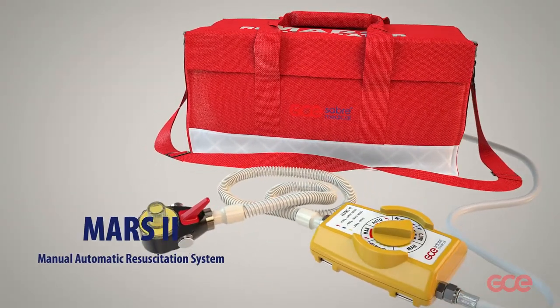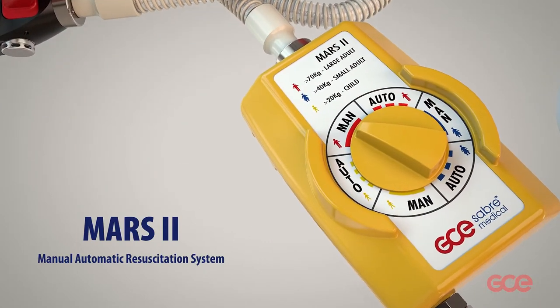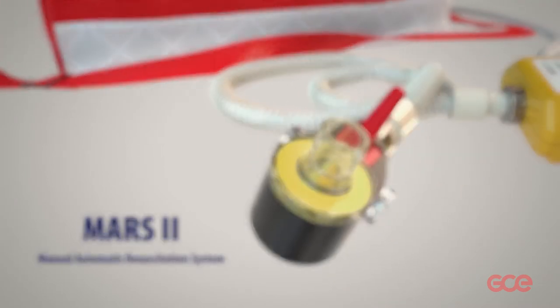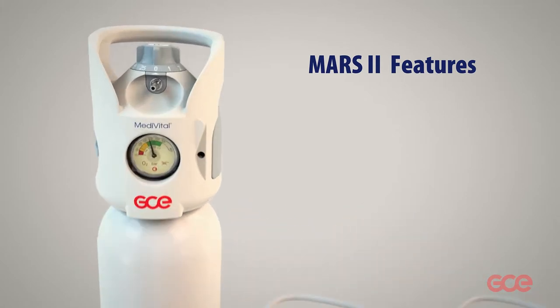Mars 2 is a manual automatic resuscitation system to be used in circumstances where oxygen is needed in toxic environments or narrow spaces where there is no access for ambulances.